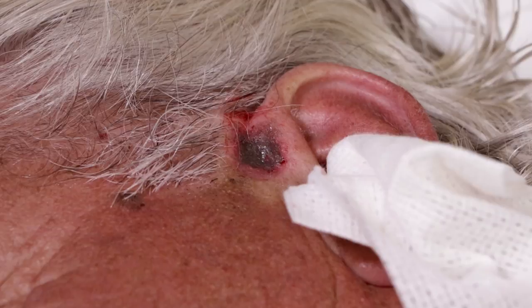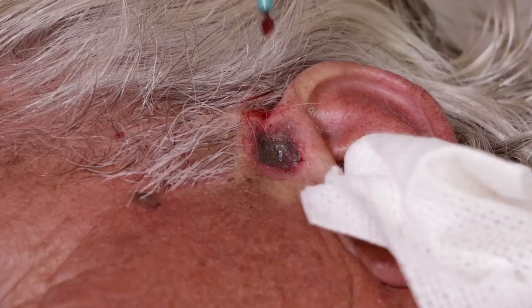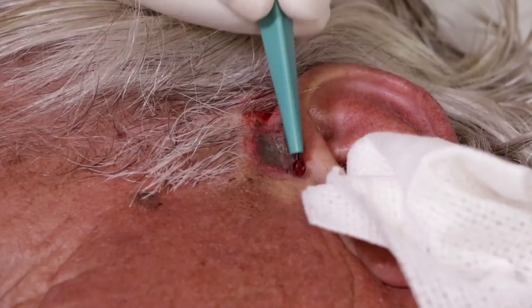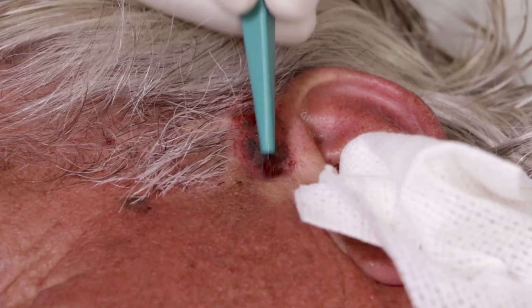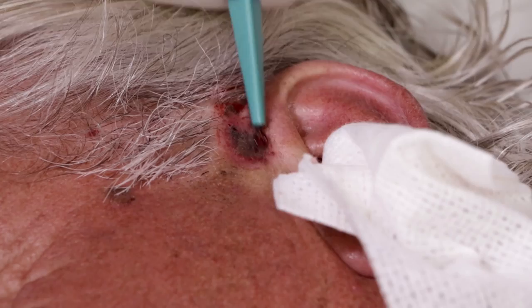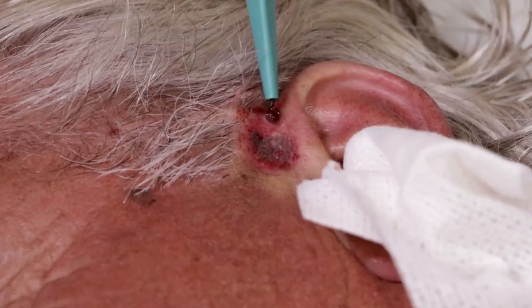Now we go through again with the curette and start scraping again. Why don't we do it with just one scraping? Because it gets too bloody. I actually don't know the exact reason the standard is to do it three times, but my assumption is that somewhere in the studies somebody found it's more effective to do it three times than once. I've gone through the textbooks and this is the standard way of doing it.